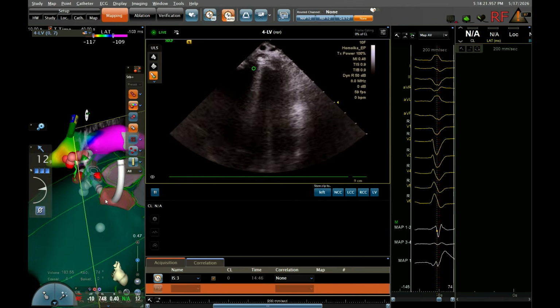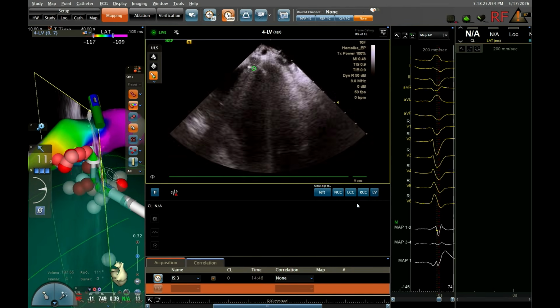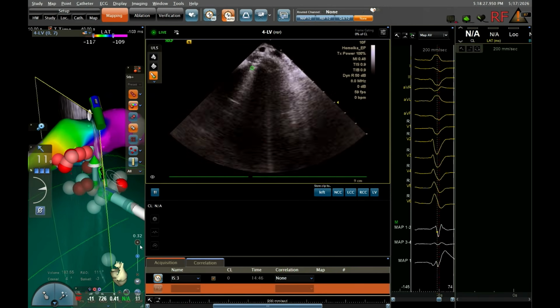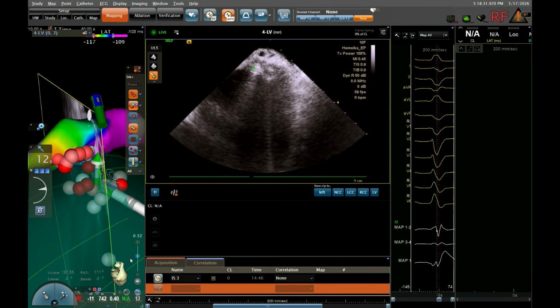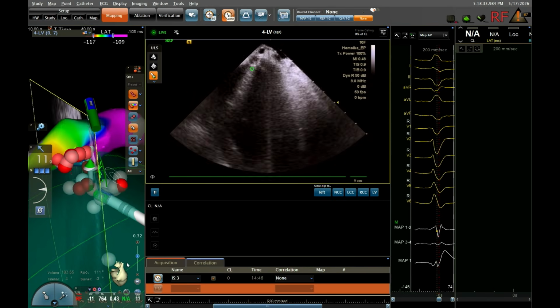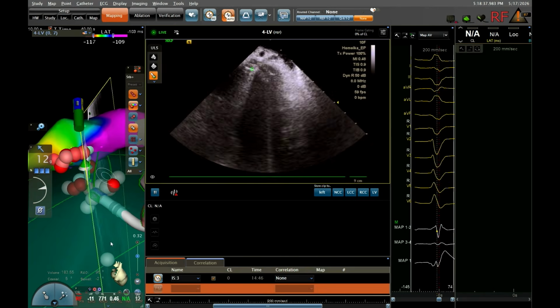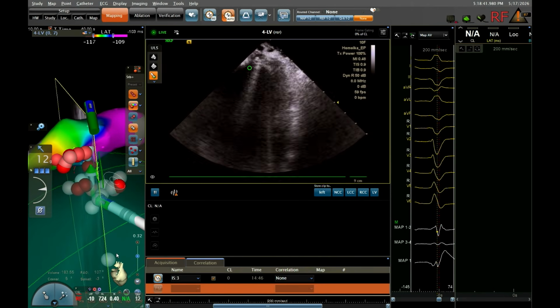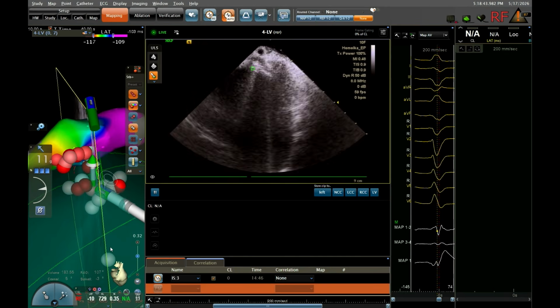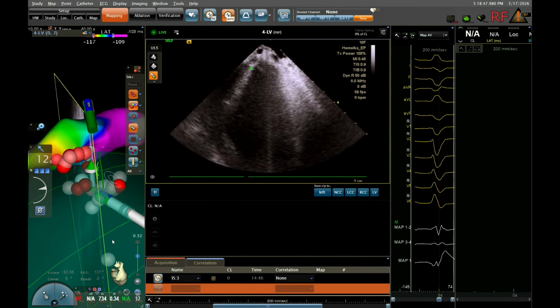And you can see there that we applied a few lesions from the endocardium right opposite to the vein. We're right opposite to the circumflex. So the consideration here, if you were to use PFA, is that you're pretty close to the circumflex. I don't have any experience of that. Obviously, RF would work. We put a few lesions right opposite for the more narrow PVC that was early, like 30 milliseconds.